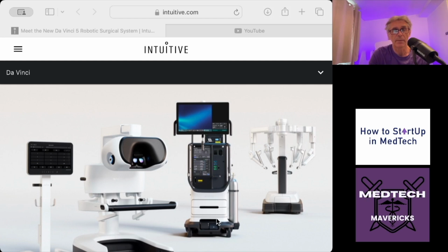It is a fully capable laparoscopic tower. As I've said many times, they're not going after the tower business, but what I think is that this knocks out a lot of towers. And I've even heard that several hospitals have recently taken full systems with a couple of extra towers so that you only need to move the console and the boom between ORs, where you could move the hub as well, which I'll talk about in a minute. But basically, you've got less things to move around. You have a completely capable laparoscopic tower, so you don't need a separate tower. And it starts to cause some collateral damage to the Strykers, to the Olympuses, and to the Storzes of the world, which I've talked about ample in my blog, and go and read that.